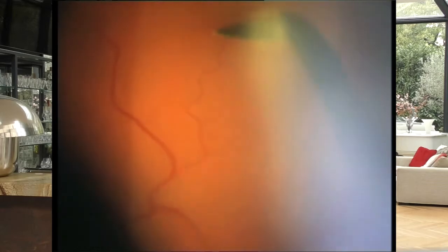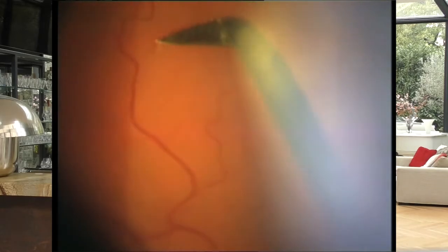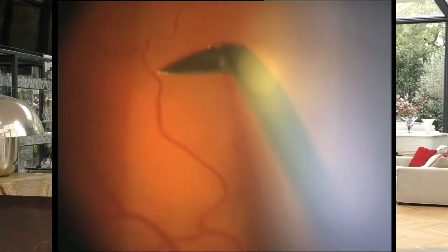But the problem with this illusion is that the procedure is very incomplete. If one passes a needle just above the retina, one is going to pull all the adherent vitreous cortex, which has not been removed during this high-speed vitrectomy.